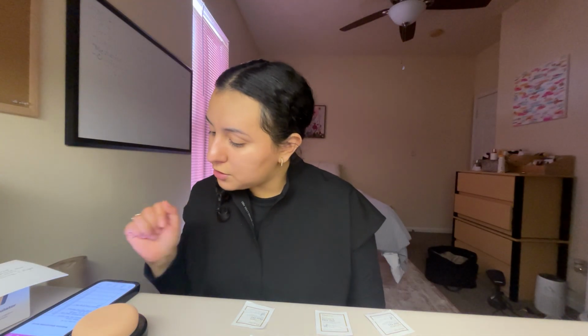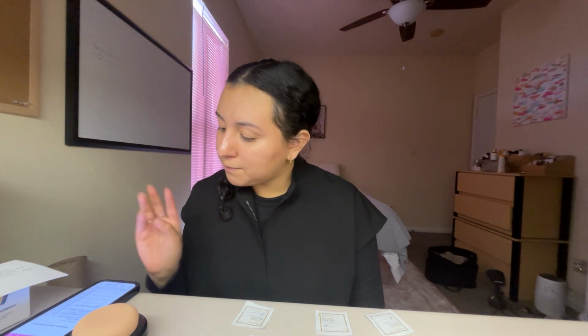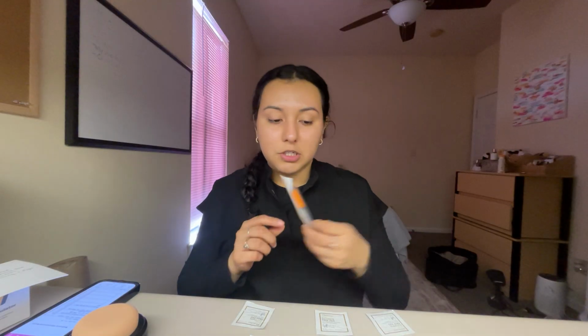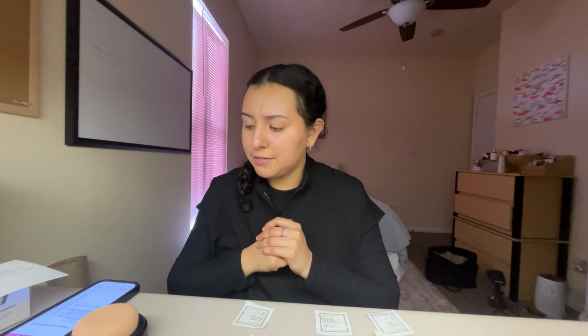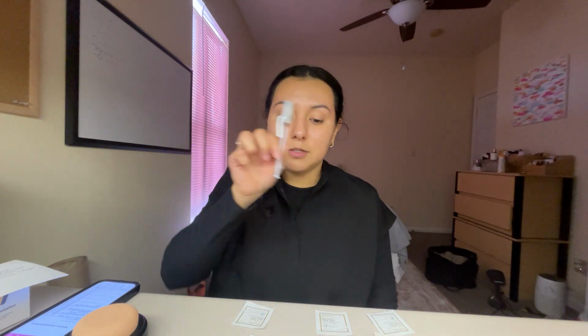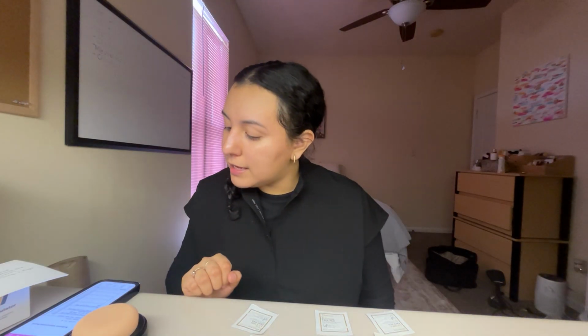Okay, so I have Humulin R, 256. So I'm going to give 6 units of Humulin, and I have my insulin syringe. And it says I have my TB skin test, 0.1 milliliters PPD. So I have tuberculin with my TB syringe.